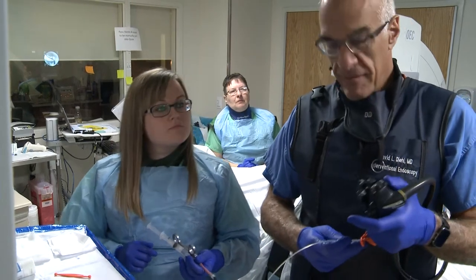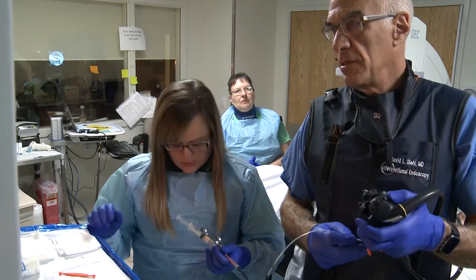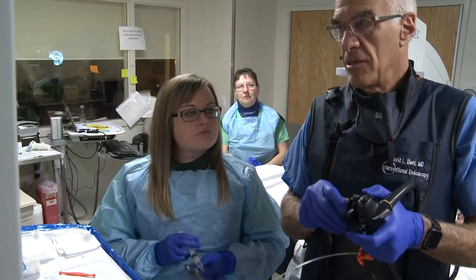All right, so I'll opacify that duct now, and then I'm going to take a stone retrieval balloon and make sure there are no stones. I believe this is papillary stenosis, not stone disease.